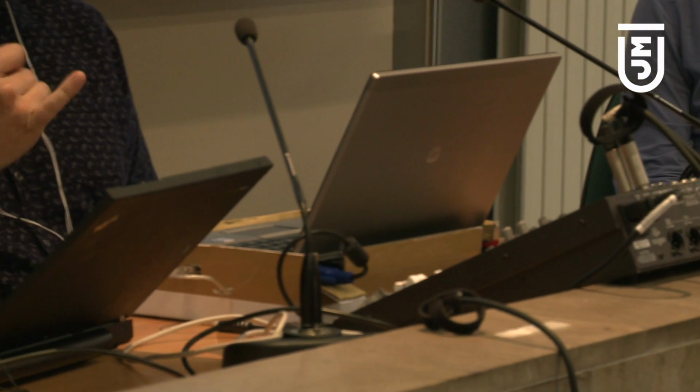So if I now create this first fit for this real fitting rule, maybe you've heard initially some feedback. In this configuration, there's no feedback suppression. It's just a simple compressor. We also provide feedback suppression, but this very simple setup did not include it, but there are other samples that you can run.